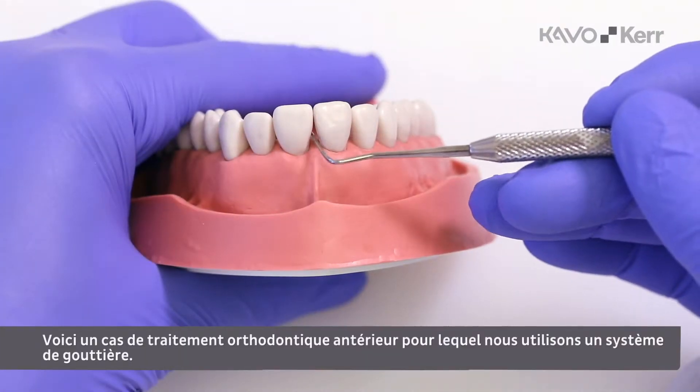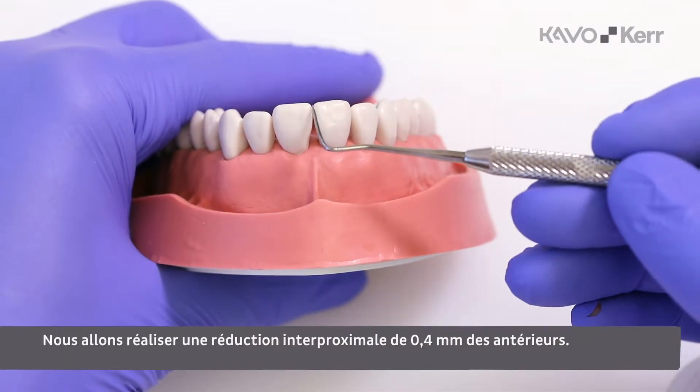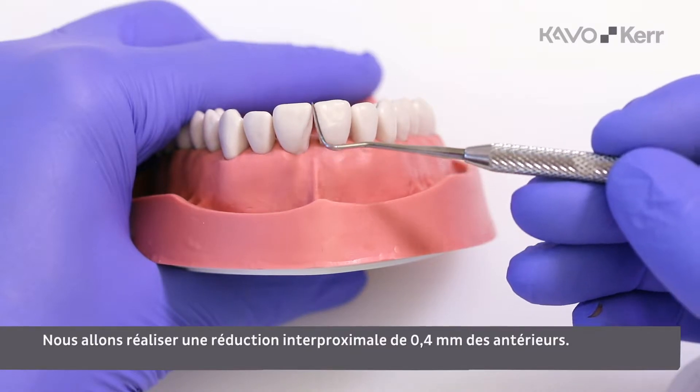This is an anterior orthocase where we are using a clear liner system. We are going to perform a 0.4 mm interproximal reduction of the anteriors.